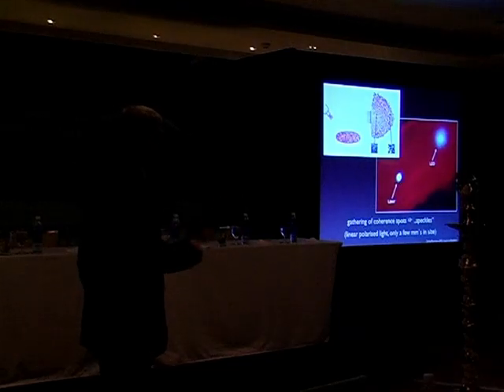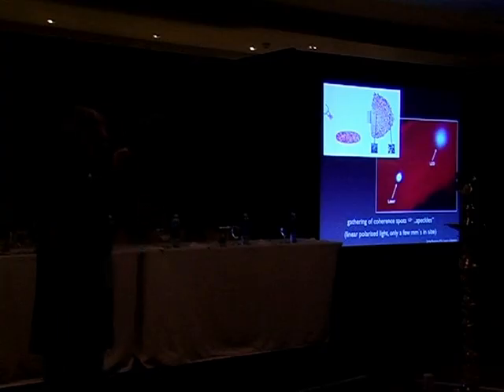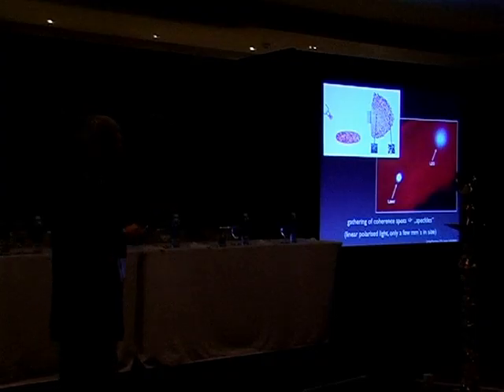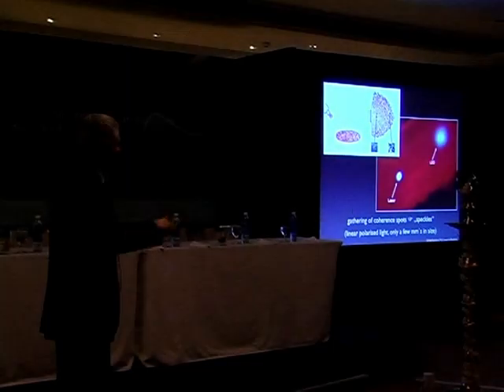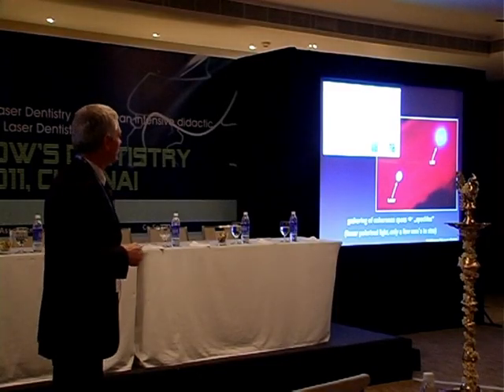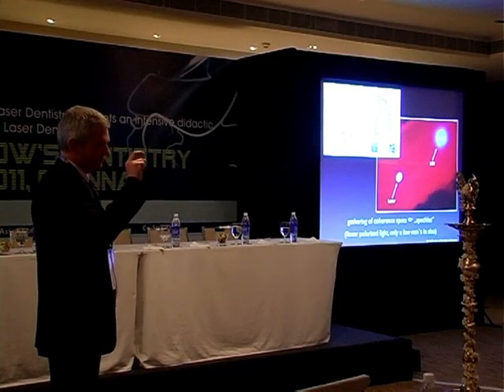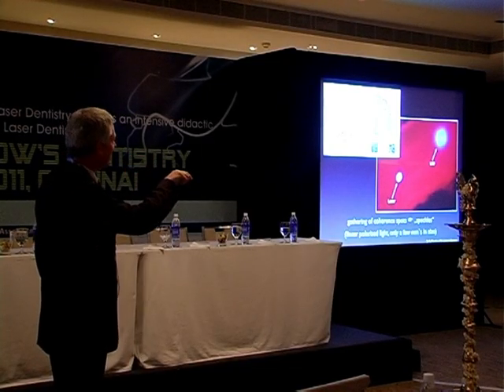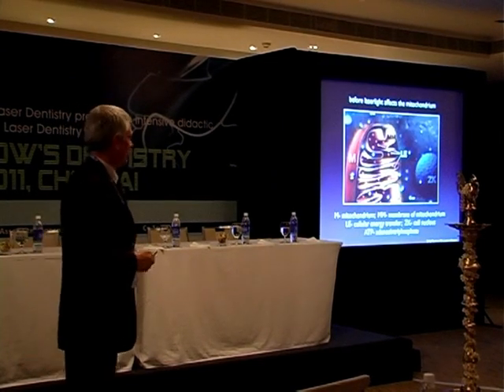With an LED light, you will see the light penetrates the tissue, and there's an absolutely clear spot. If you penetrate a very thin layer of, let's say, meat with a laser, you will see a lot of dancing spots at the lased site. And these are called speckles. They are little spots of polarized light with only a few millimeters size, which are dancing in the tissue. And these little speckles influence the energy transfer of the cell.